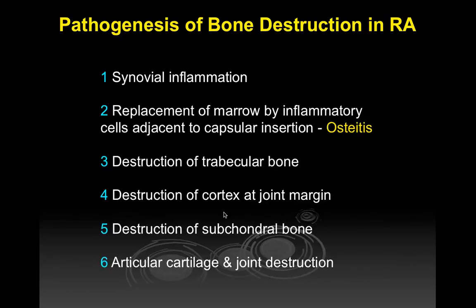And you can see at this point, you can see it by CT or plain films. Before this stage, you cannot see it by CT or plain films. And before this stage, you can't see it by ultrasound either. So we'll get to why that's important.